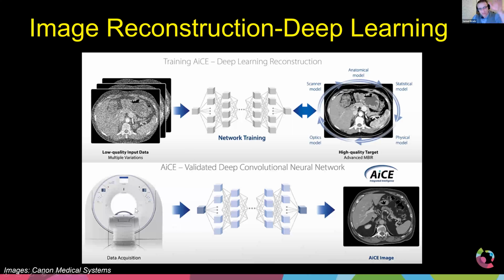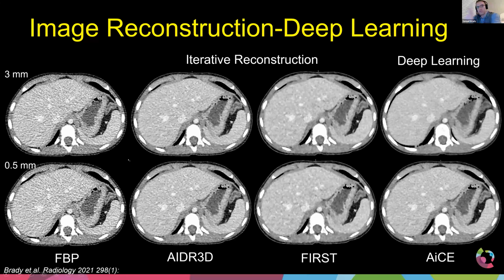Now, when the patient climbs on the scanner and goes through, it takes the image and immediately takes it apart and goes, okay, here's the noise and here's the anatomy. And it puts it back together without the noise. And that's basically what deep learning is. And it's just phenomenal in the quality and the direction we've been able to go with our iterative reconstruction over time.